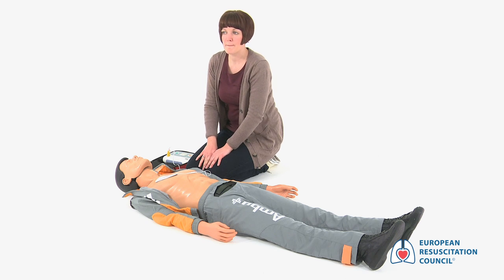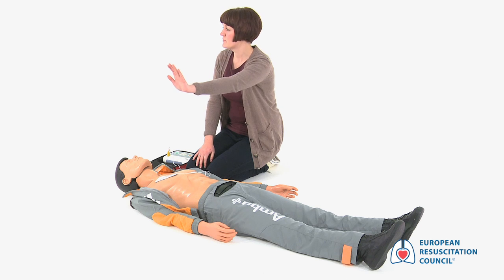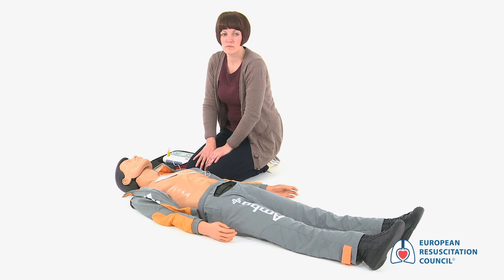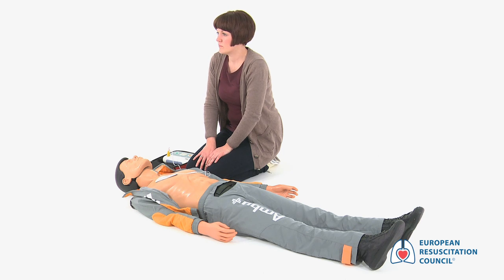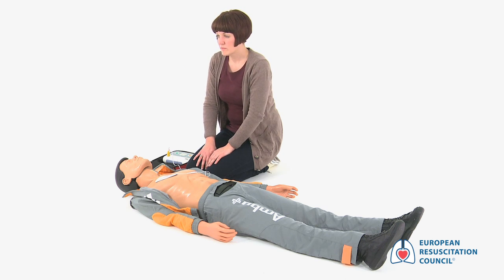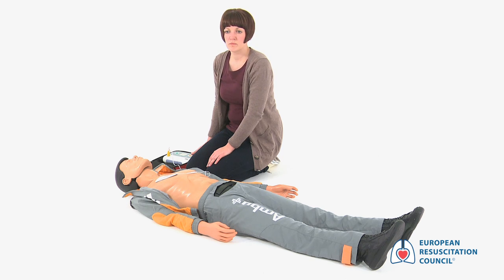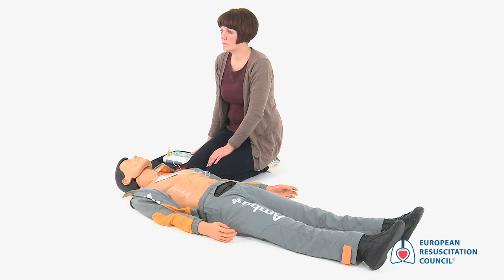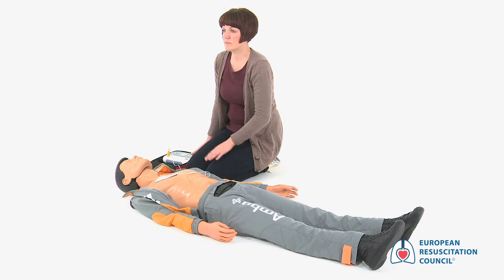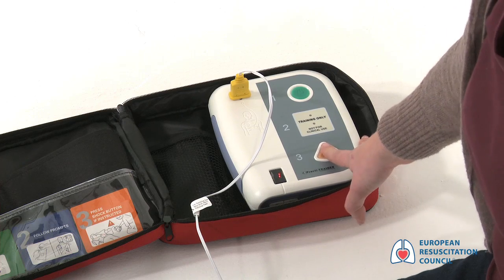Analyzing heart rhythm. Do not touch the patient. Stand clear. Shock advised. Charging. Stay clear of patient. Stand clear. Deliver shock now. Stand clear. Press the orange button now. Shock delivered.